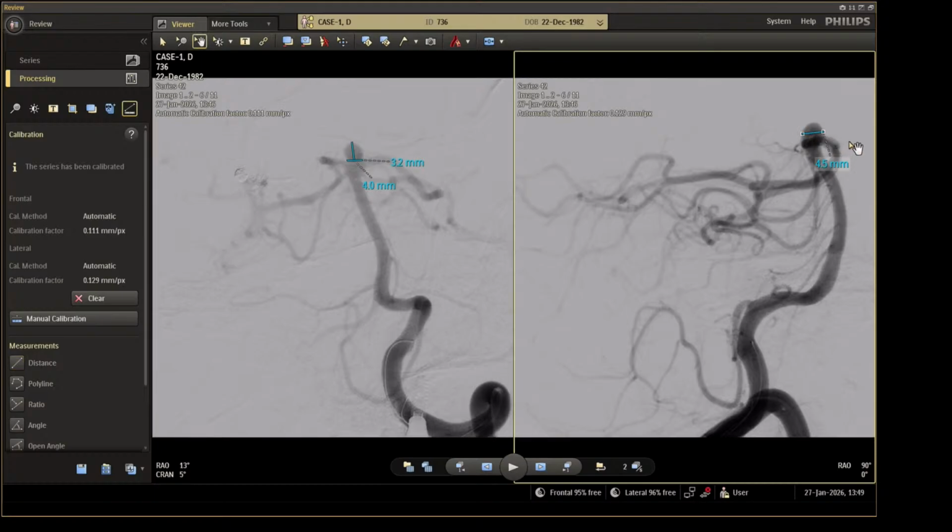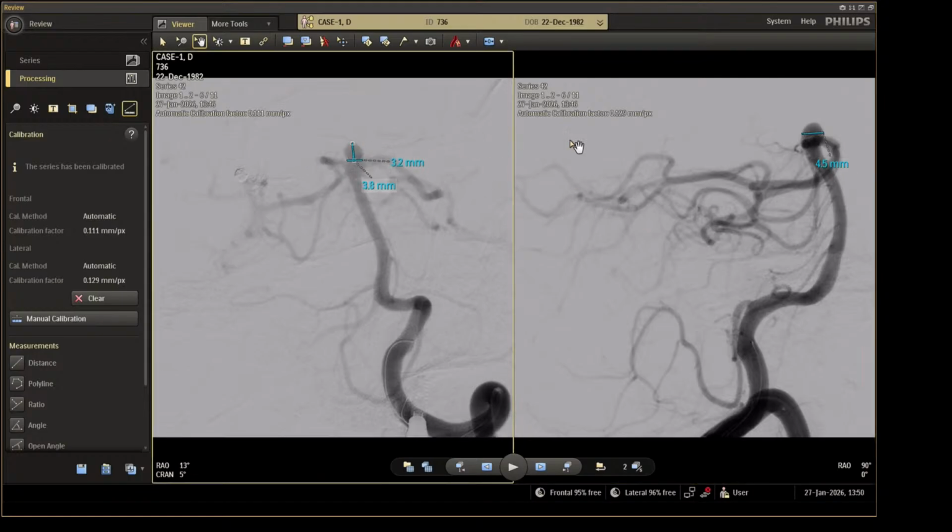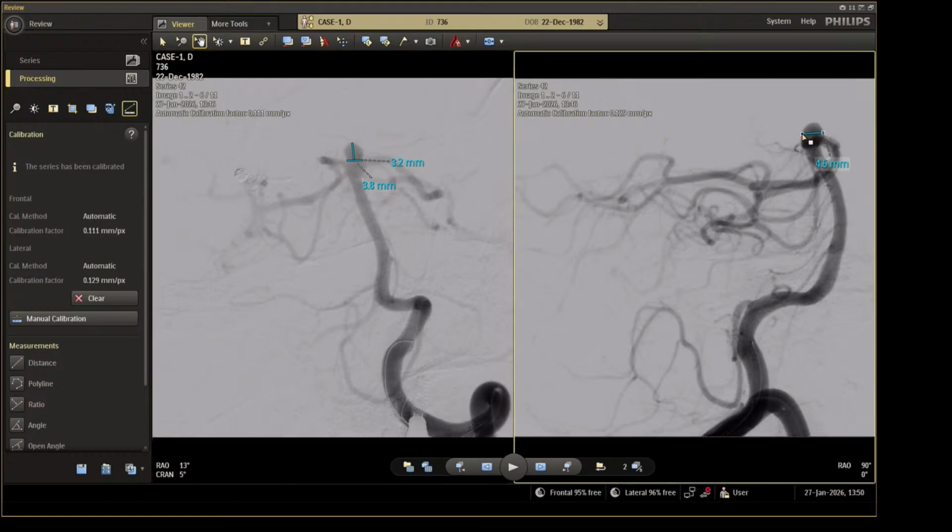4 Optima. 4/13 Optima complex soft. It will be first coil. Then we will ask for the next one, then it will be helical 3/4.